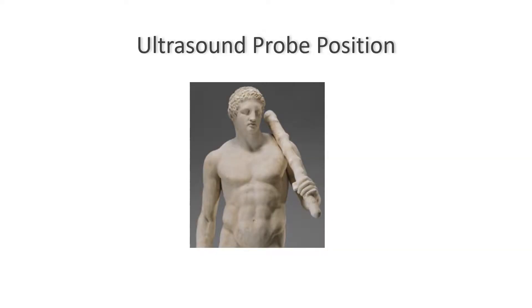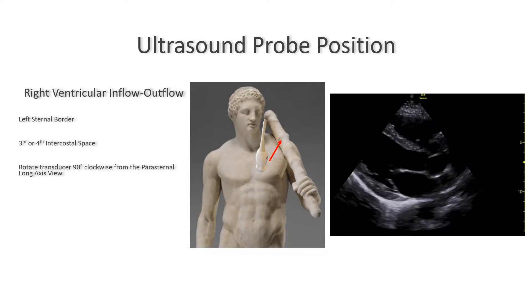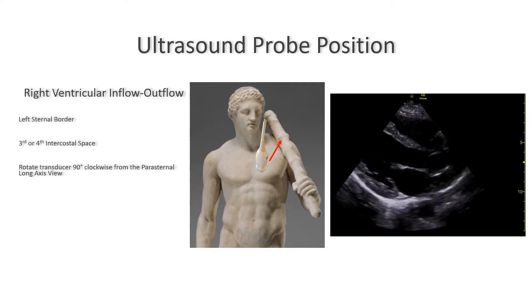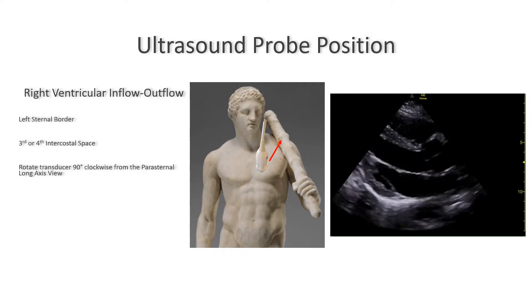Let's first talk about the ultrasound probe position. The fastest and easiest way to get the right ventricular inflow outflow view is to first get the parasternal long axis and rotate the probe 90 degrees clockwise, keeping the aortic valve at the center of the image. Take a look at this video and see how the parasternal long axis will become the right ventricular inflow outflow view just by rotating the probe.